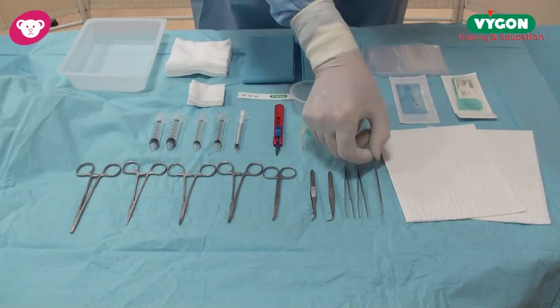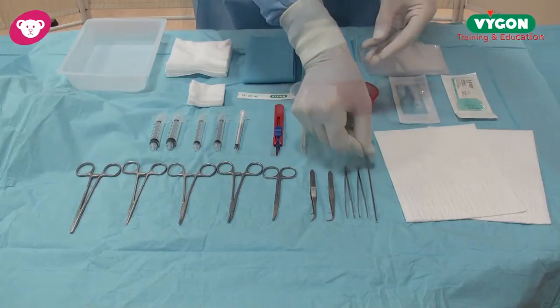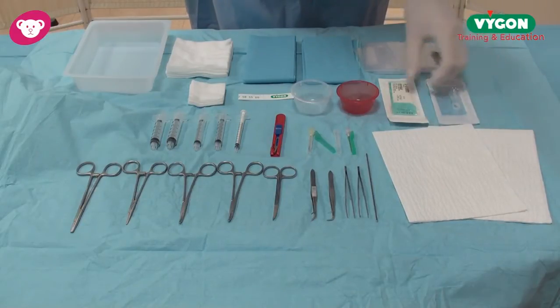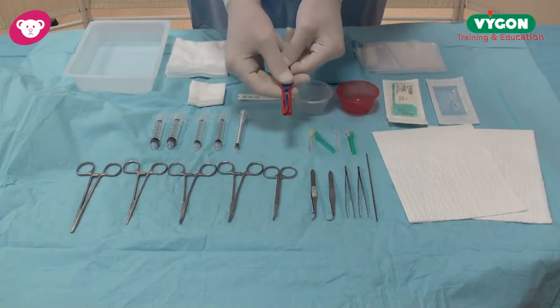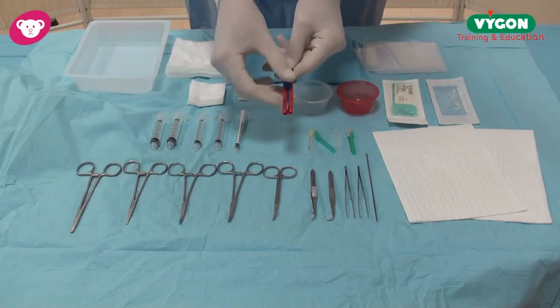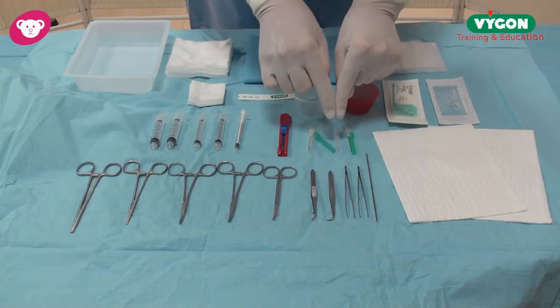A very important point here: we have the vessel dilator, we have two absorbent towels, an umbilical cord tie, a 3-0 silk suture, three safety devices here — one safety scalpel, so after use it can be retracted into the safety position — and two hypodermic needles which are also safety.